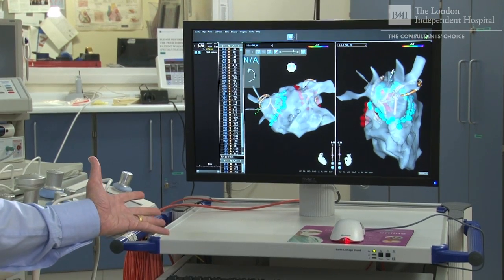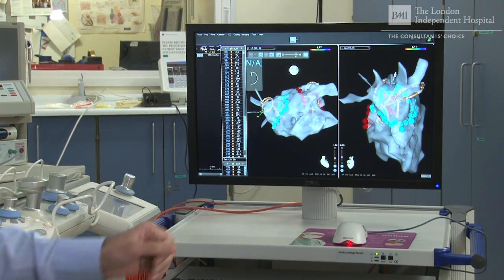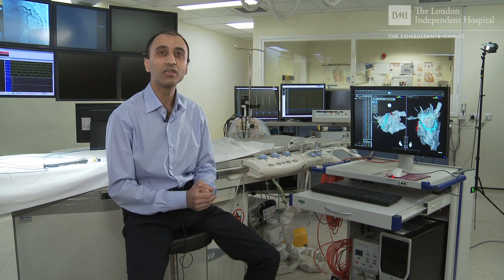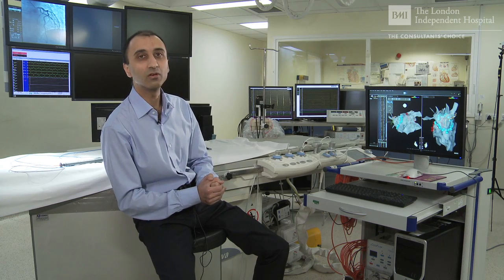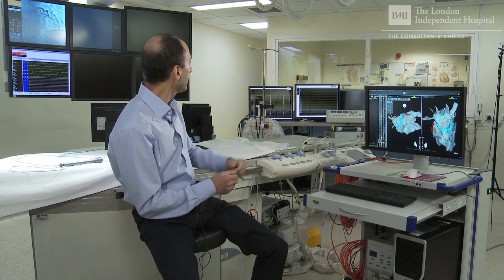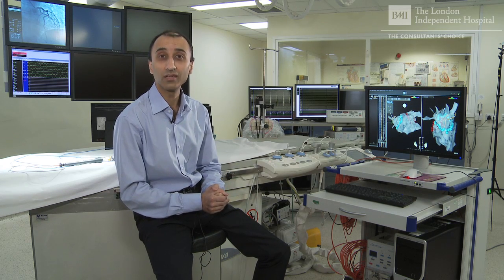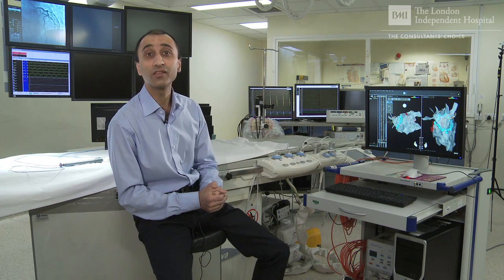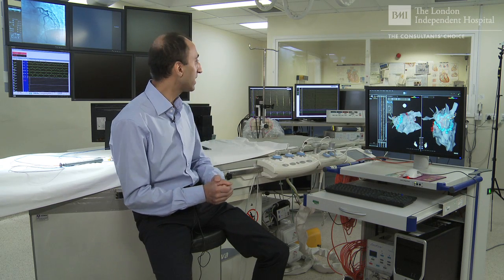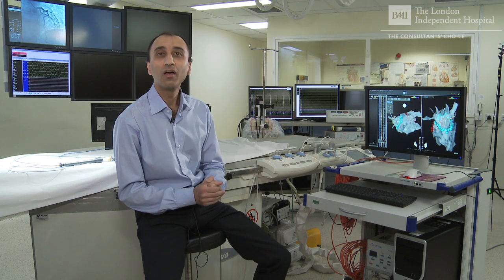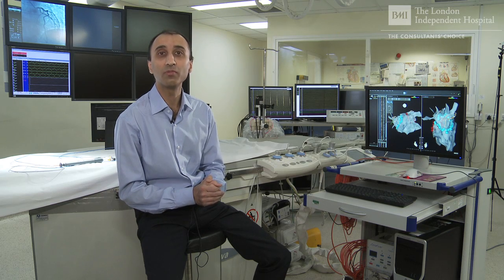The entire ablation procedure is guided by two mapping computers. One is this three-dimensional mapping computer known as CARTO, and we have the latest version of this system here at the London Independent Hospital, which has important innovations that make the procedure safer and easier. Further behind we have the BARD mapping system — on the left-hand screen you can see electrical signals recorded during a recent case. The yellow signals represent electrical activity from inside the pulmonary veins, and the white signals are from the tip of the ablation catheter. On the right-hand screen you can see the yellow signals have completely disappeared, which is what we expect to see at the end of the procedure when the pulmonary veins are silent.